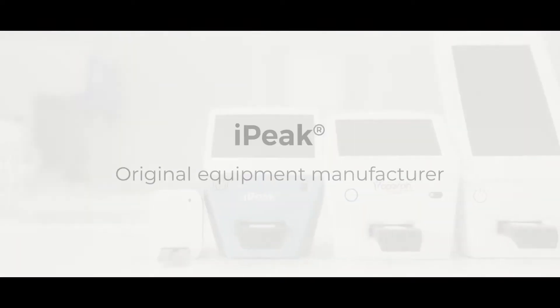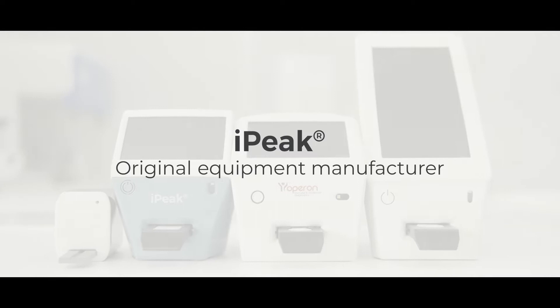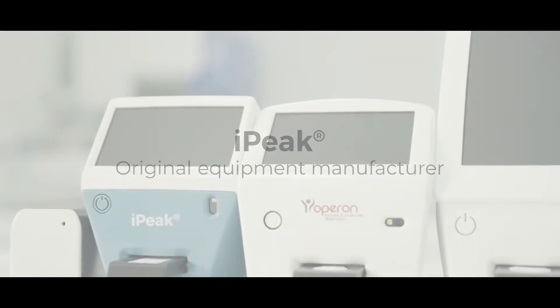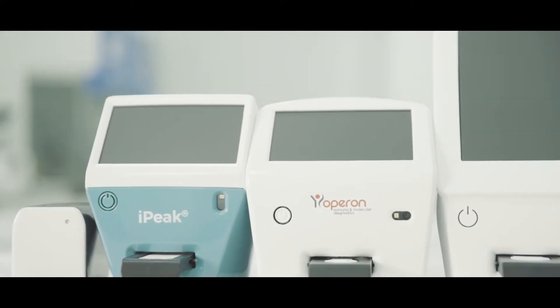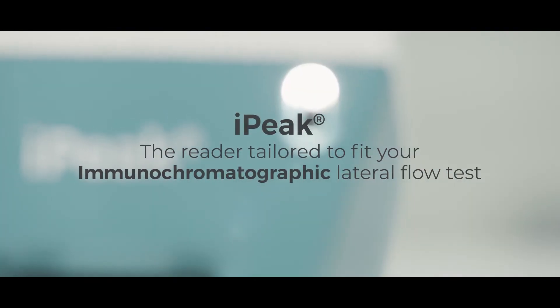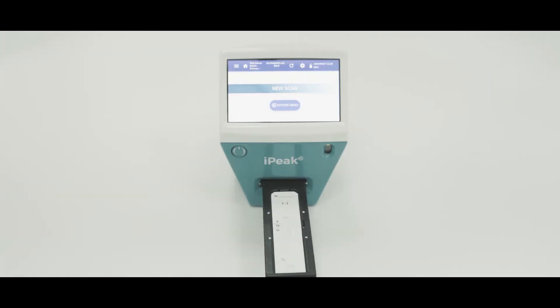IUL, iPeak original equipment manufacturer. For a unique cassette, a unique reader. iPeak, the reader tailored to fit your immunochromatographic lateral flow test.